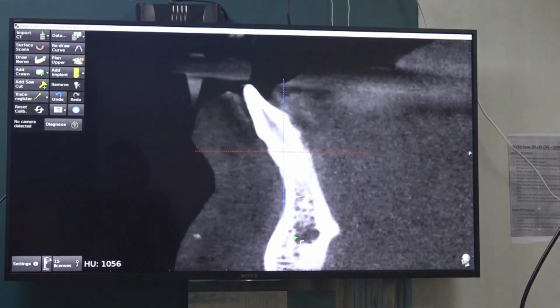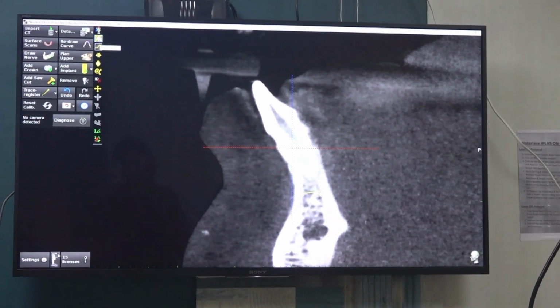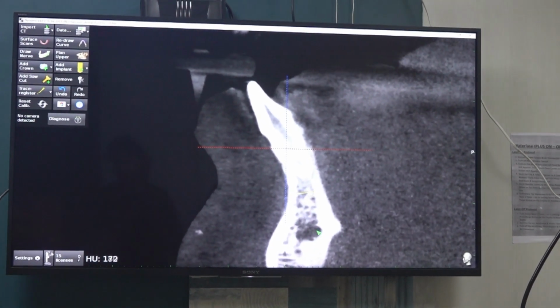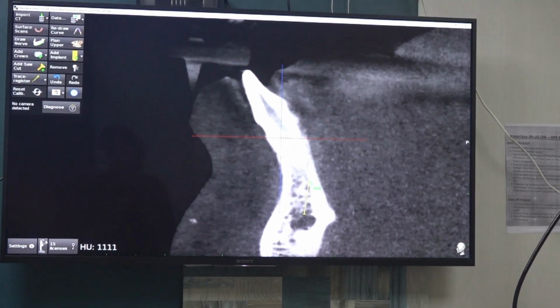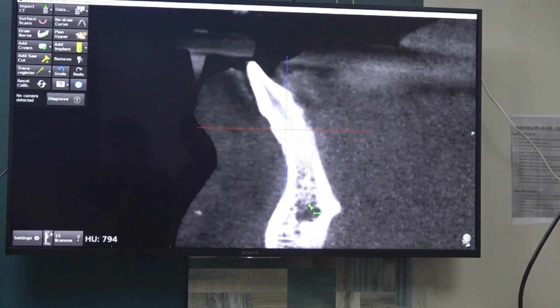So this is a tricky situation. But here you can place a basal very comfortably. If you see the black space here, there is no need for the implant to go till here. It is unnecessary. So you can stop short here. This comes around 17 mm.